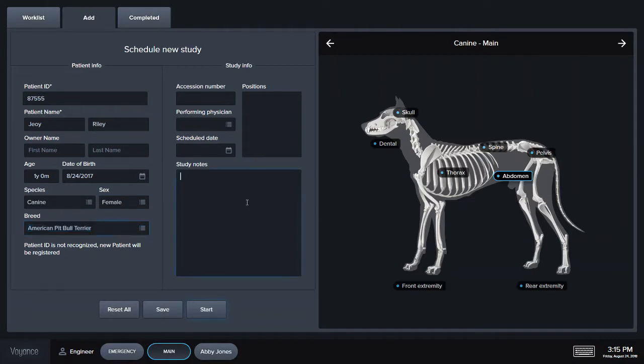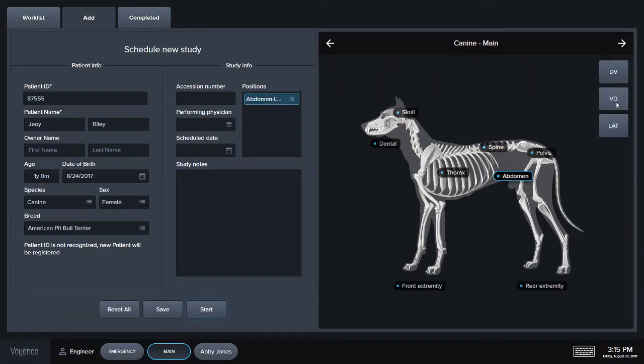You can enter study notes about the patient and then select which images you would like to take. Once I'm ready, I press start and I can begin taking my x-rays.